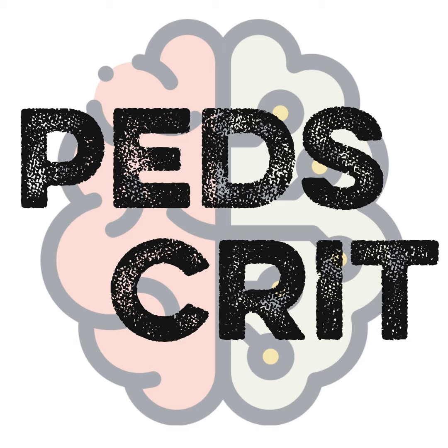In the cardiac ICU for us, it's a post-cardiotomy, right? After a cardiac surgery, it's always very easy. It's going to be a central cannulation. As opposed to kids who have not recently undergone a surgery, usually it's going to be a kid that comes into the PICU, right? It's going to be a peripheral cannulation. Your cannula size depends on the baby's weight.